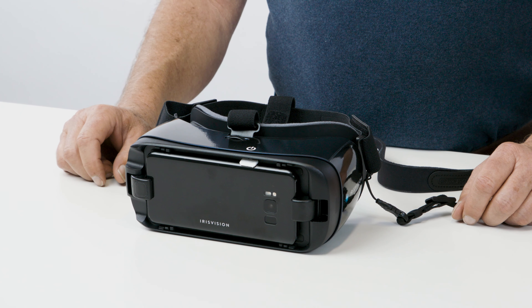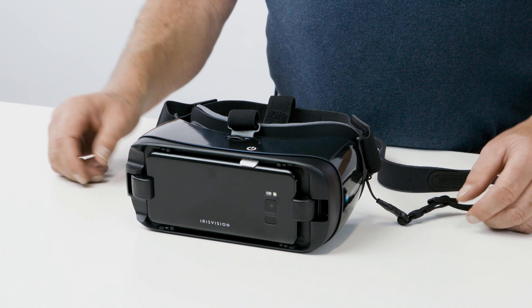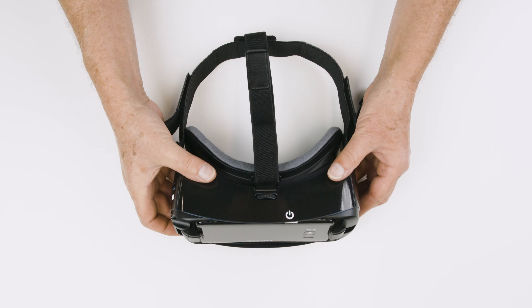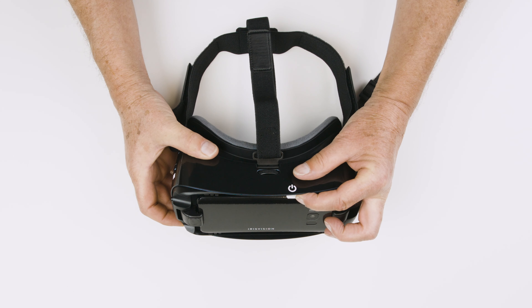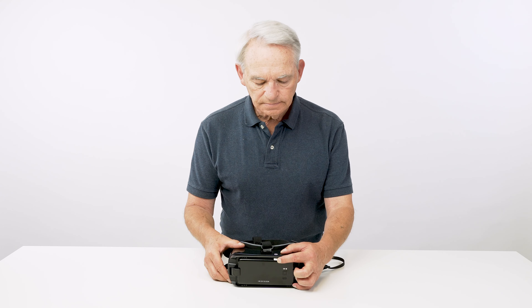Here is the IrisVision. Turn the device so the front bearing the IrisVision logo faces you. Hold down the white tab for five seconds to turn on the device. The device will vibrate when it powers on.